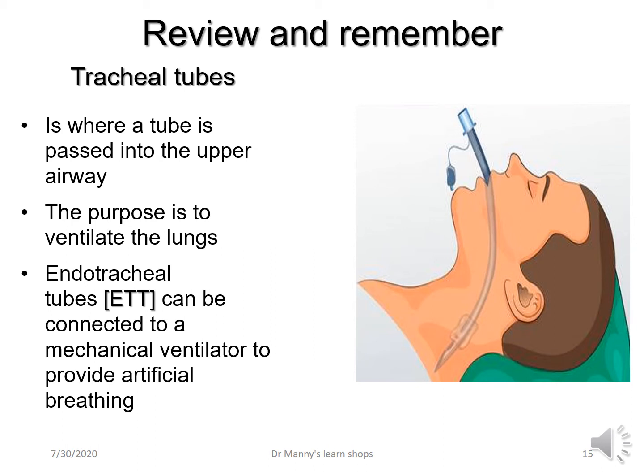Tracheal tubes on chest X-ray. Tracheal tubes, remember, is any tube, whether it's endotracheal, whether it's orotracheal, whether it's nasotracheal, whether it's a tracheostomy tube. This is a tube that's passed into the upper airway or into the trachea directly through the skin. And the purpose of a tracheal tube is to allow ventilation to occur, whether it's manual with a bag device or whether it's with a mechanical ventilator. But both allow artificial breathing.